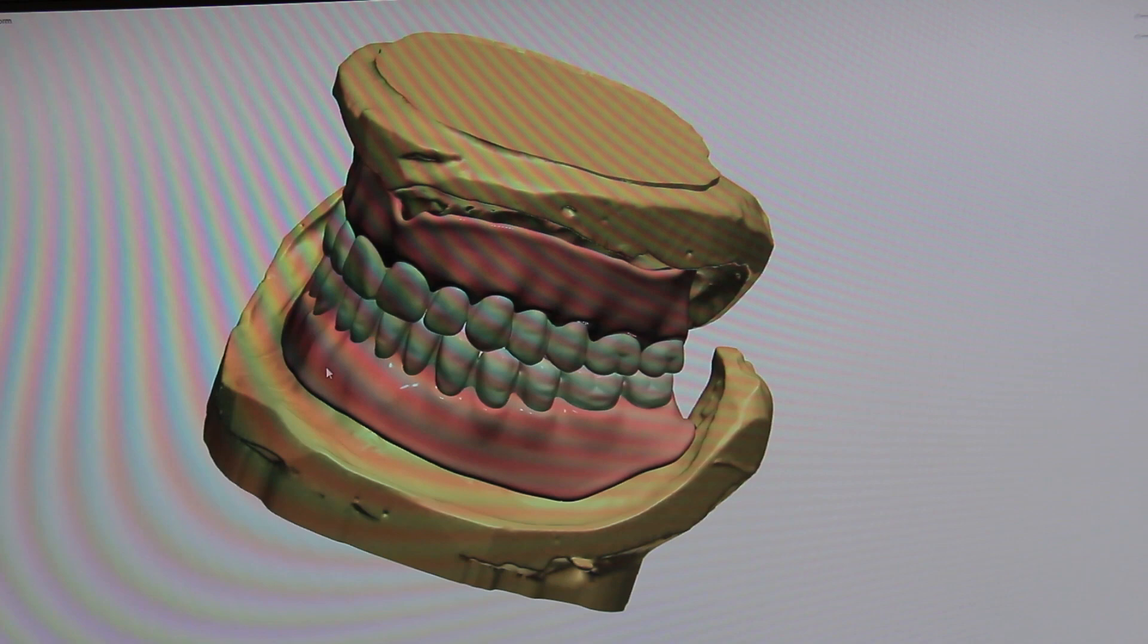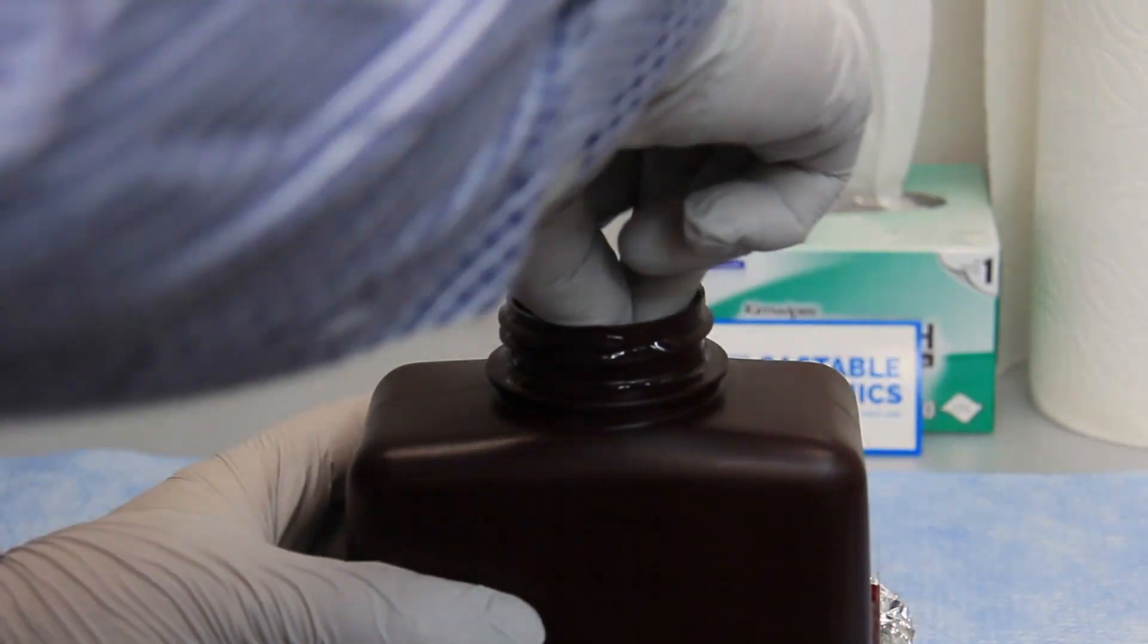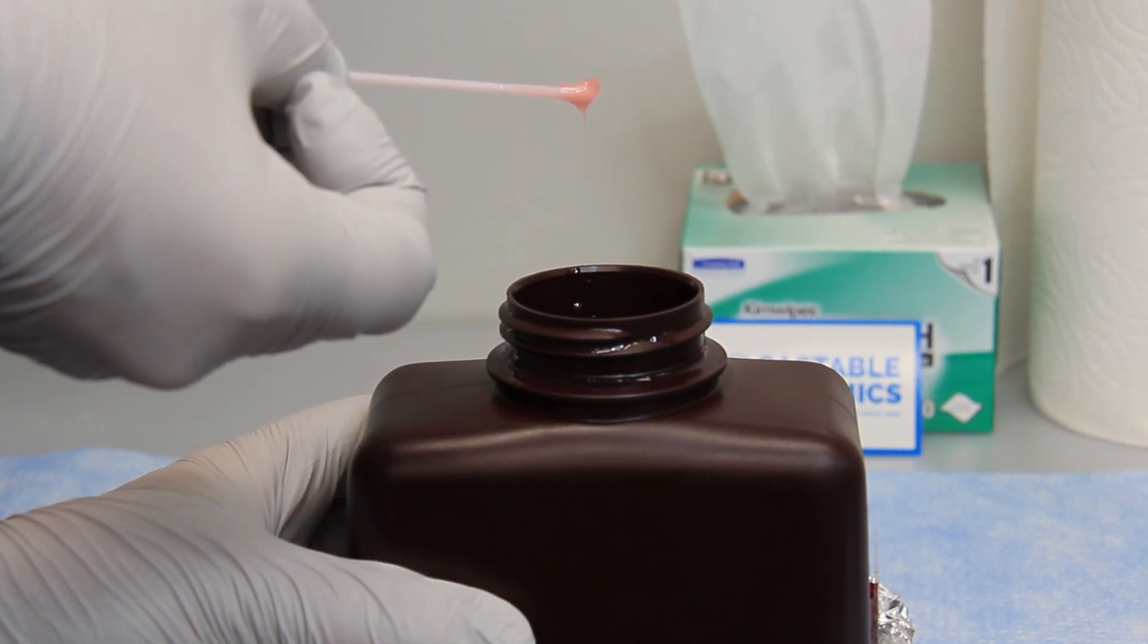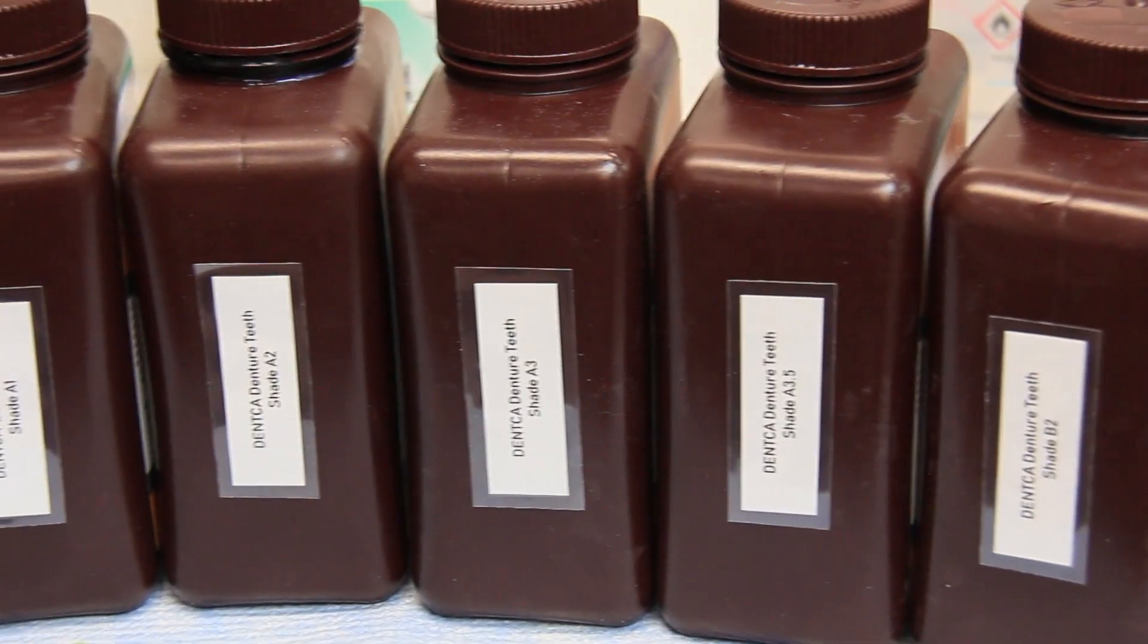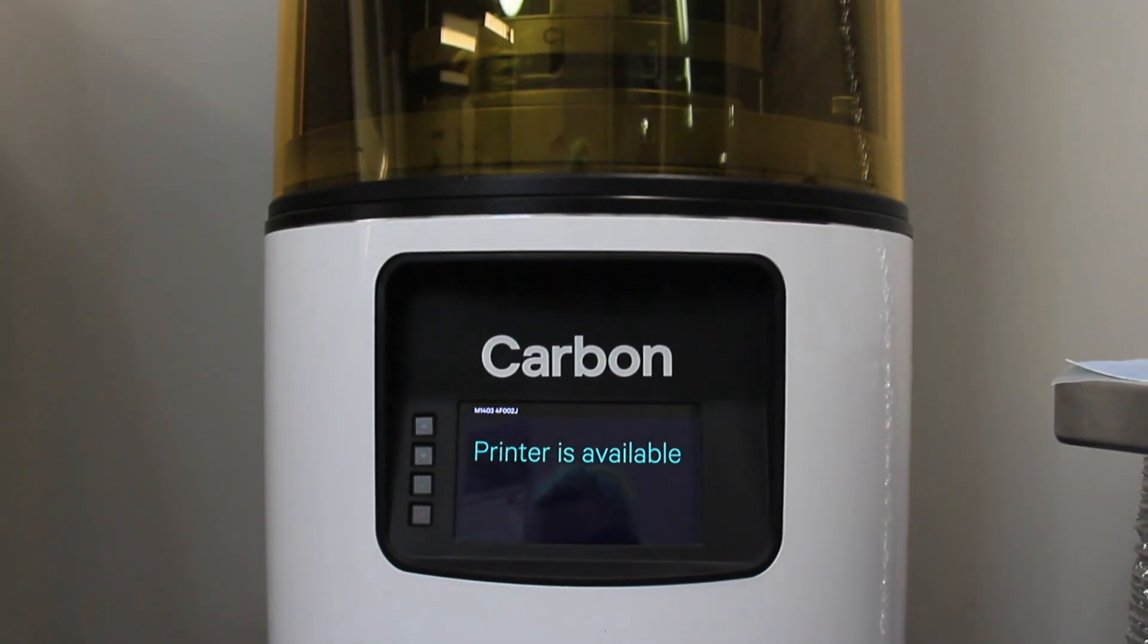Once the design is complete, the denture can then be fabricated. 3D printed dentures are made from a very specialized programmable acrylic resin. There are many different resins to choose from depending on the final color desired for the teeth and gums. Once the appropriate shade is selected, the printing can begin.